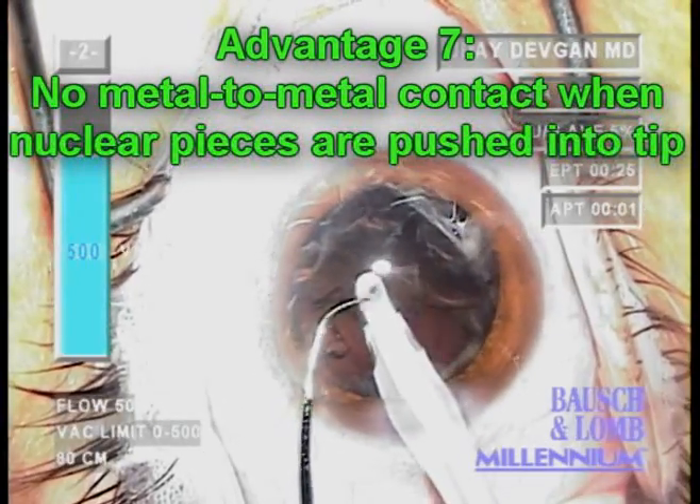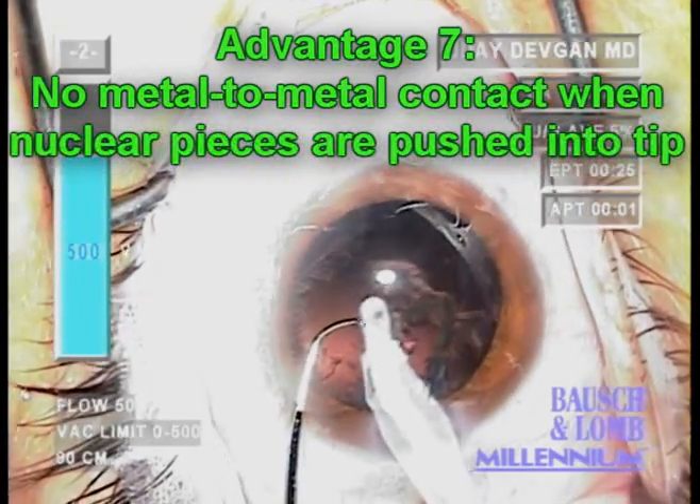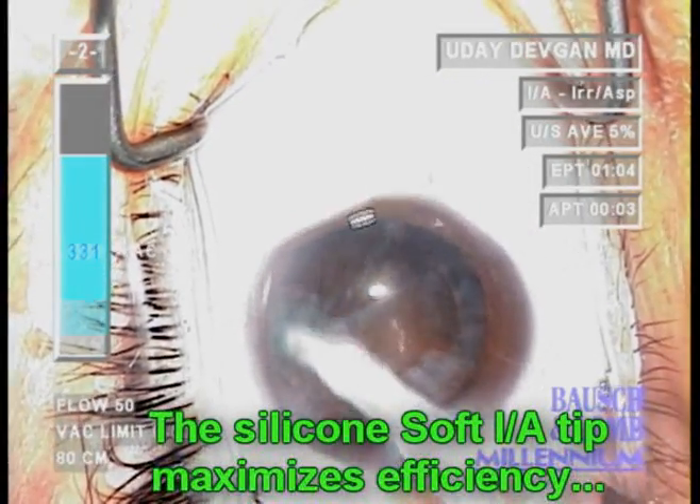Finally, there's no metal to metal contact when we use a second instrument to push nuclear pieces into the aspiration port. For these reasons, the silicon soft IA tip maximizes efficiency.